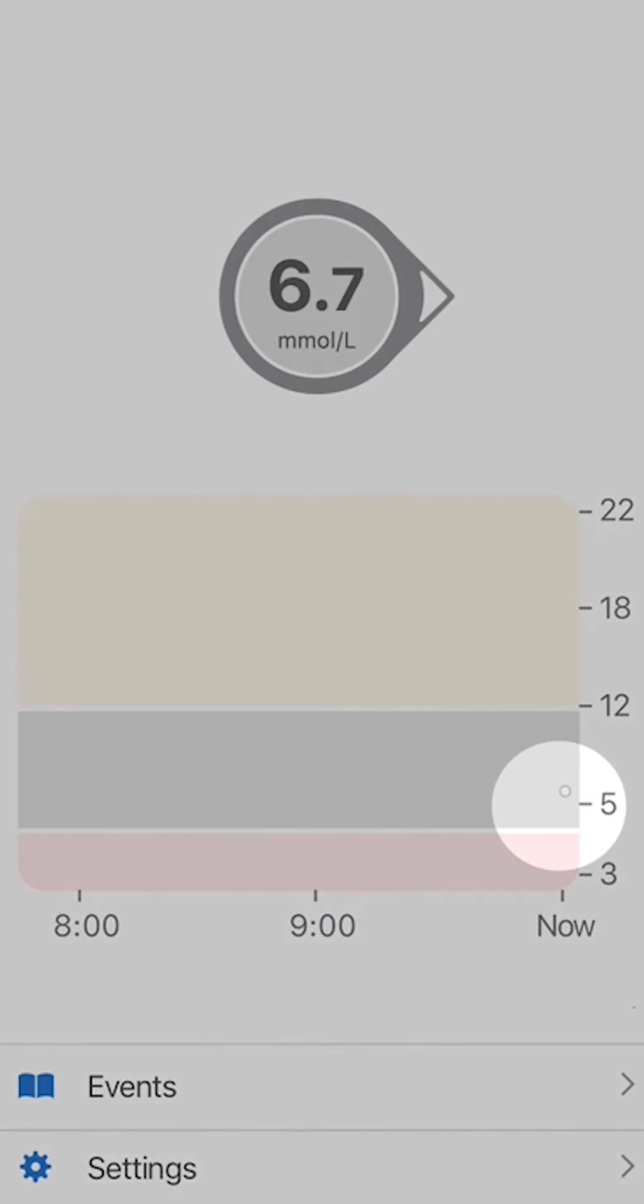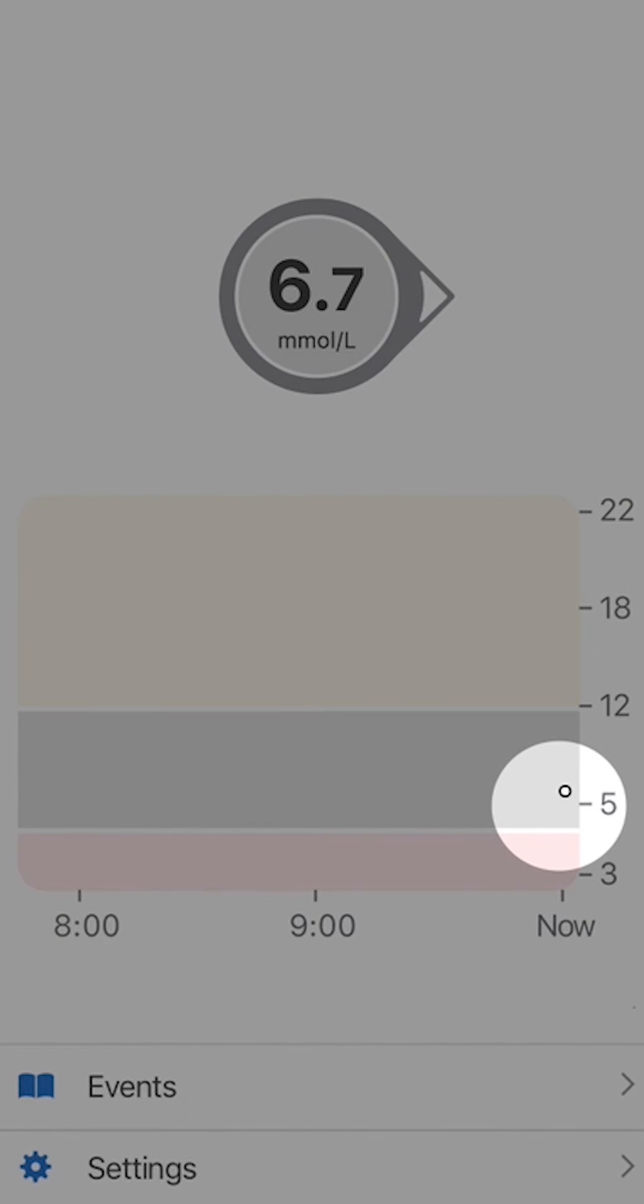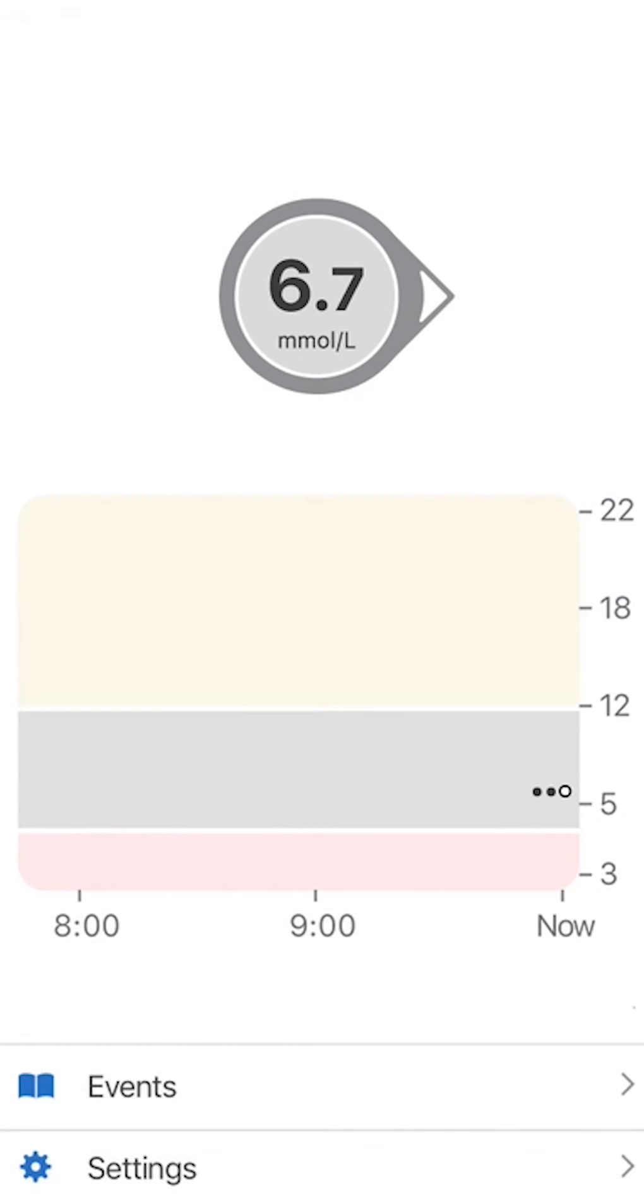See the dots? Each dot is a G6 reading, taken every 5 minutes from your sensor. Your current G6 reading is the dot on the right. The dots on the left show the last 3 hours of G6 readings.